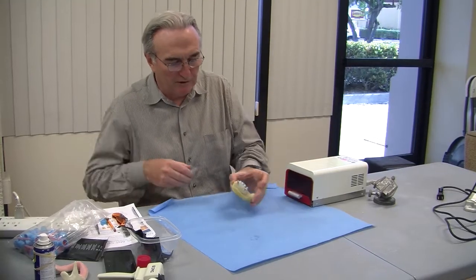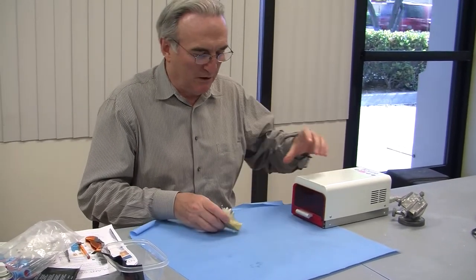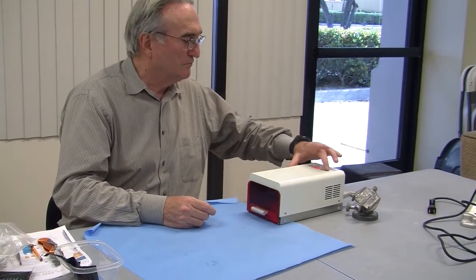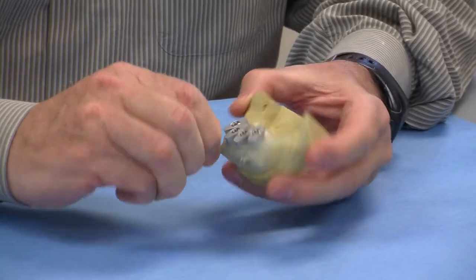We found the most effective way is to cure the Triad by 3 minute increments. After 3 minutes, we recommend to move the pin in and out.